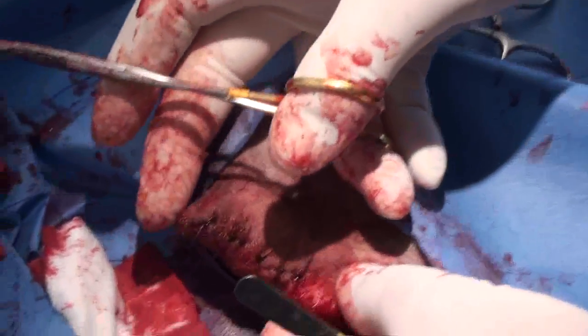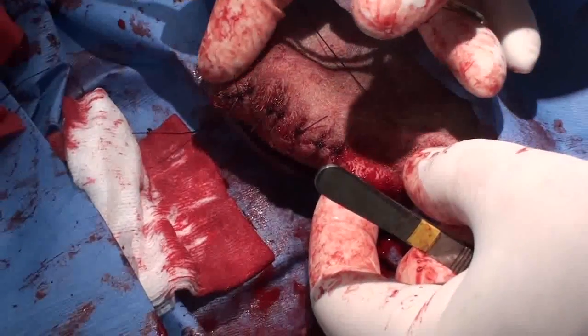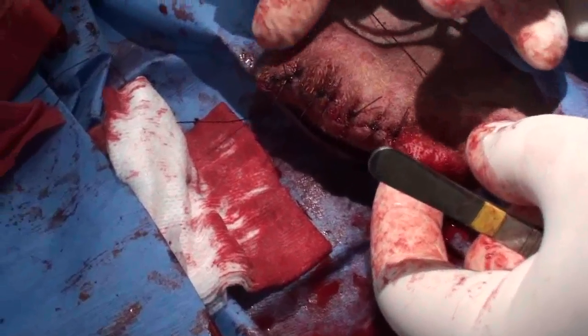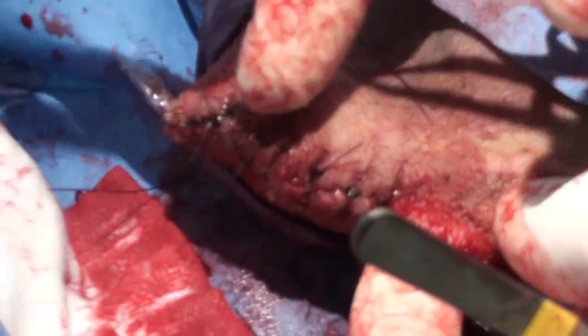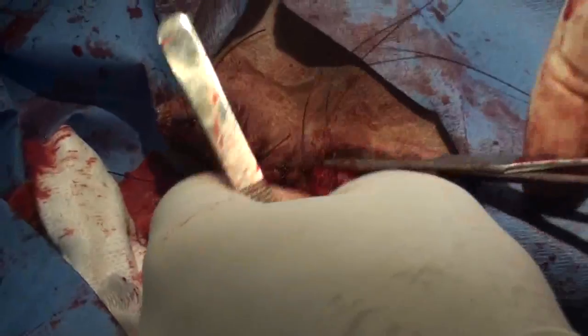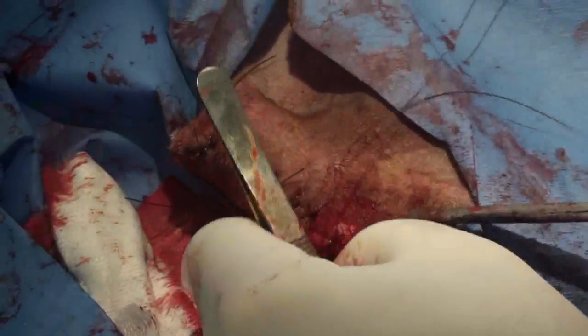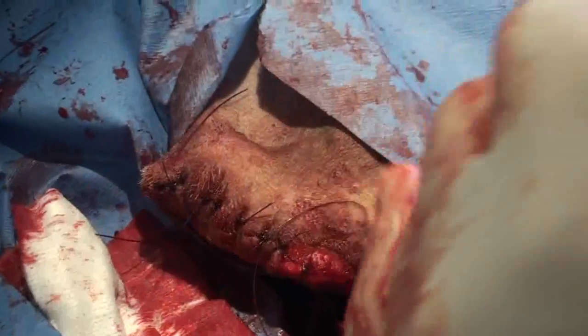As you can see, we've sutured up the wound with what we call simple interrupted. The stitches go in on top, all the way down — in one side and out the other, on top. Unlike the subcutaneous suture that went inside, this is the outside suture.